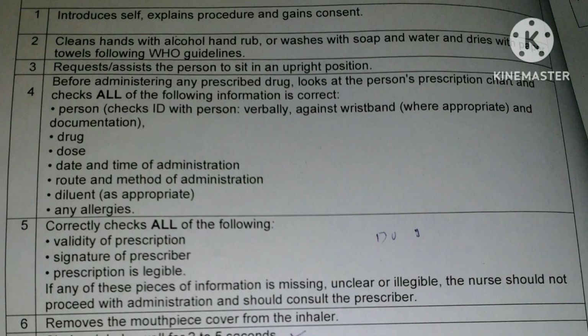First, we have to assess the area for safety. Then we have to perform hand hygiene. Then introduce ourselves, explain the procedure and get verbal consent from them. We should explain everything in detail and gain consent prior to starting any procedure. It's mandatory. Then we should ask the patient whether they need any assistance to sit upright. We should request them to sit in an upright position. That is the position we use for inhaled medication administration.